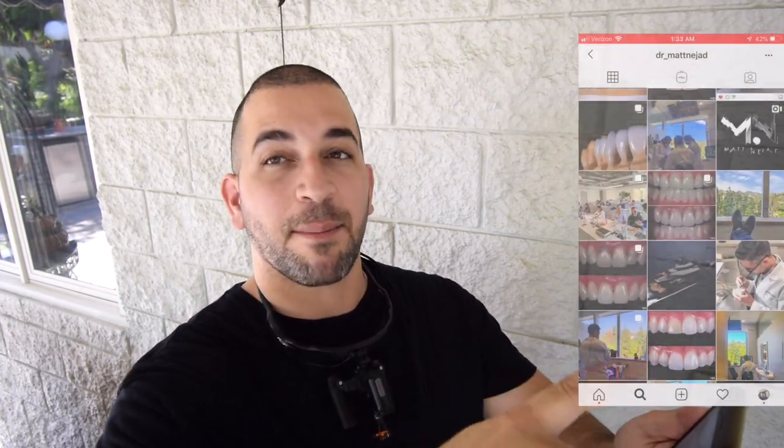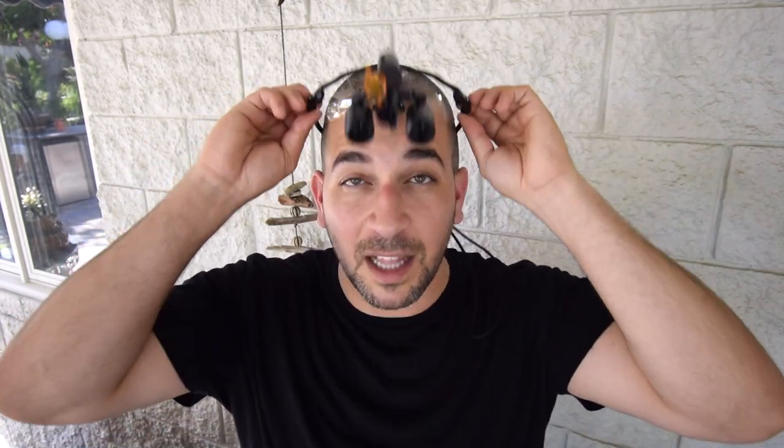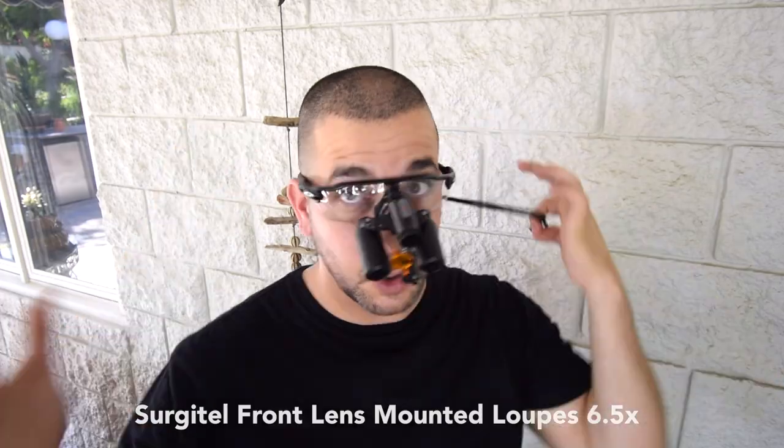Surgitel first caught my attention as I was swiping through my Instagram feed, and I noticed that some of the dentists that inspire me use Surgitel to perform incredible biomimetic dentistry every single day. As I dove deeper into the company, I discovered its focus on true ergonomics. A couple of emails later, a meeting with the CEO of the company, and now I'm excited to share my new loops — the Surgitel FL-M 6.5 Mag Loops.